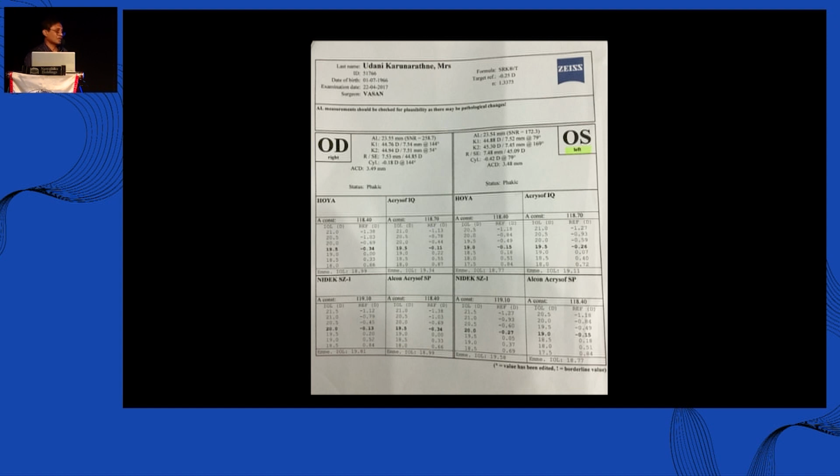Then, when they are equal, if the lens powers are different, then again I will ask him to go back and check. That's number 2. If you double check and you get the same result, then you will go back and see what the powers are, and you will see the lenses of your choice and see how they compare. So that's what I usually do.